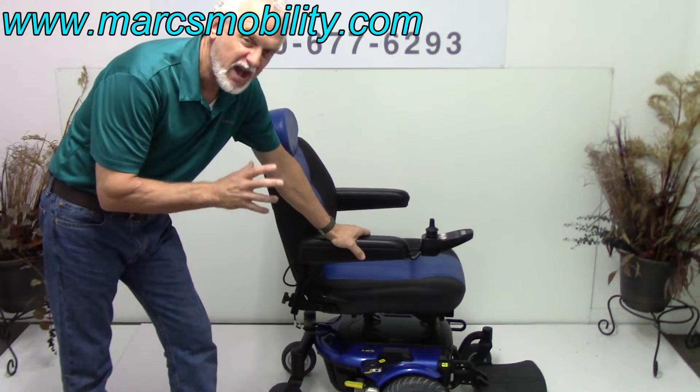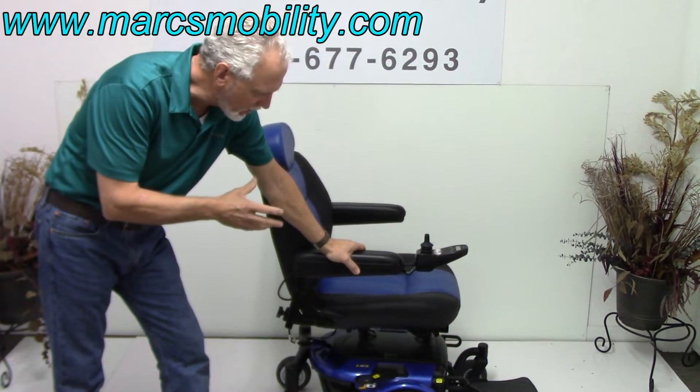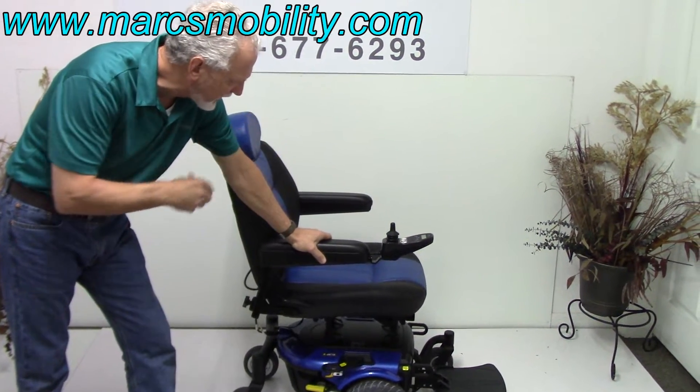This is a Pride J6 power chair. This one has custom seating — the seat was upholstered the same color as the chair, which makes it a custom seat. Very sharp looking black and blue tone color all the way around, very nice.